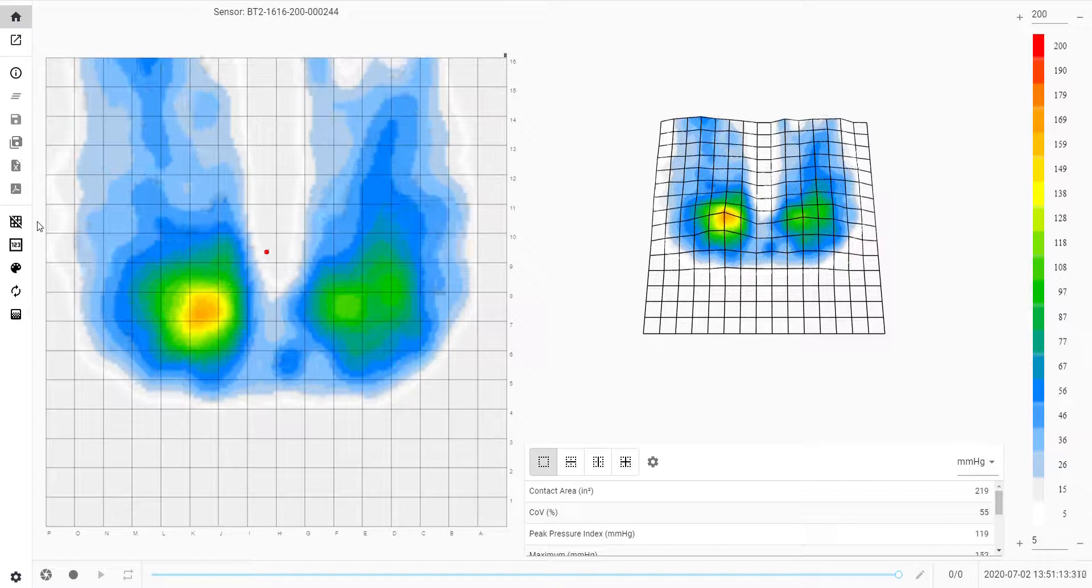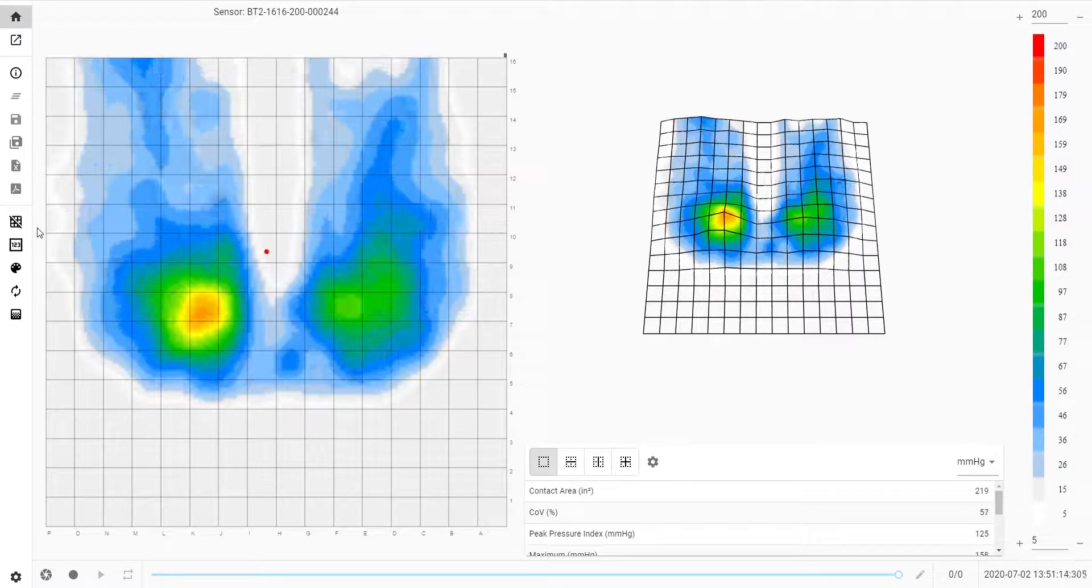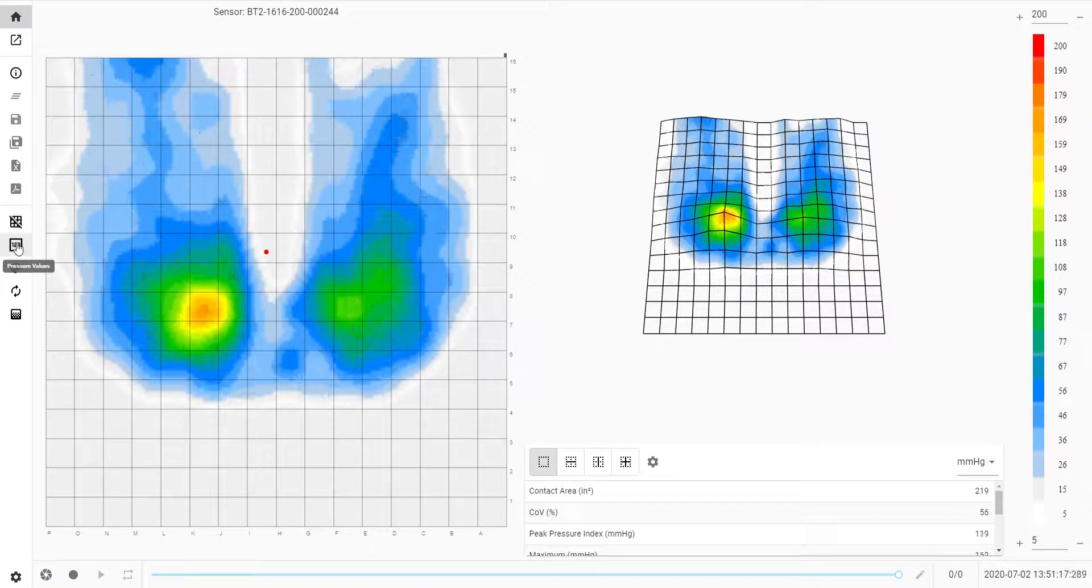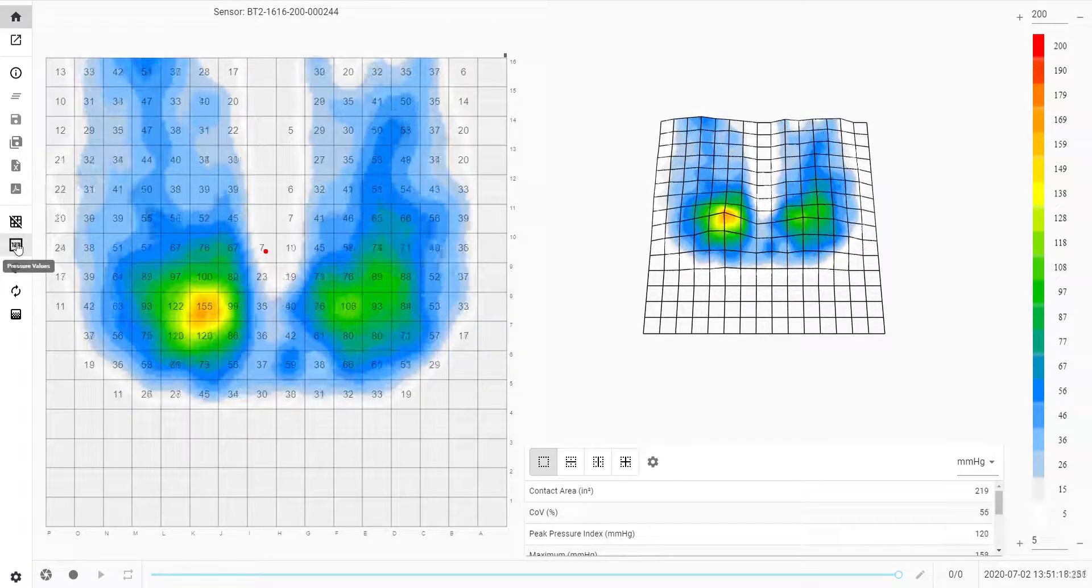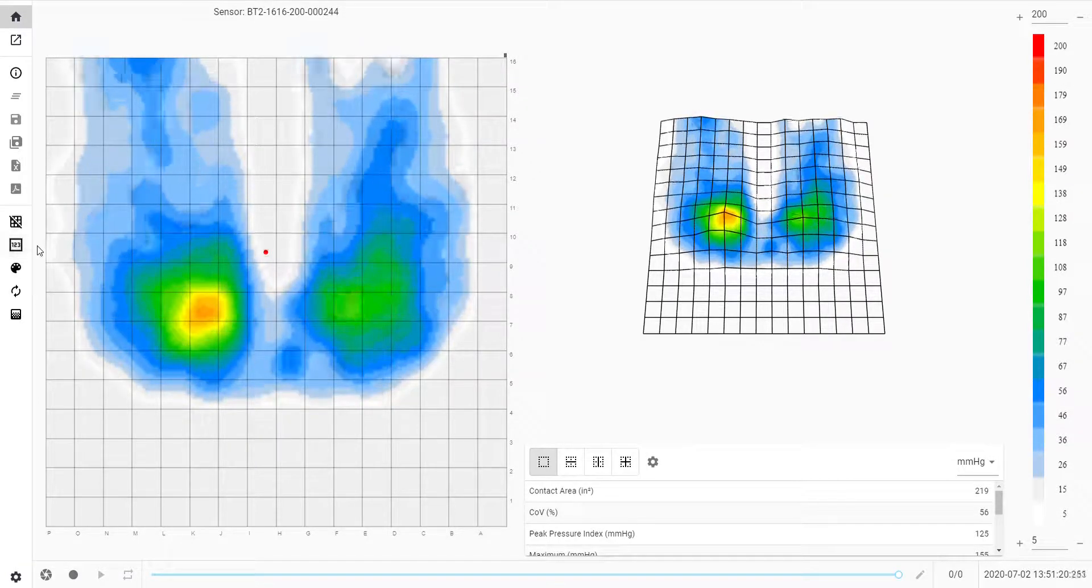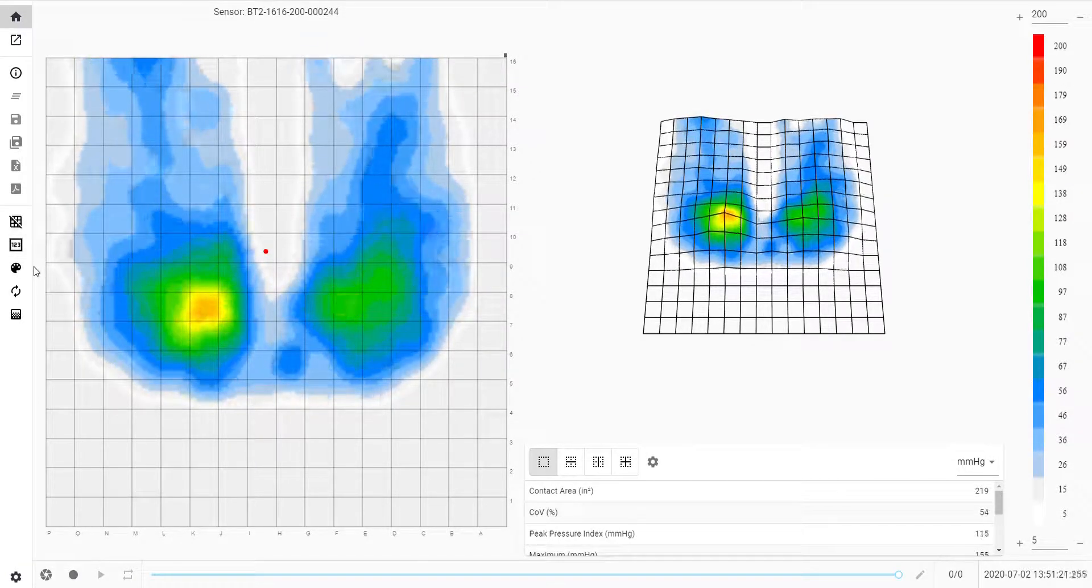Next up you can click on the pressure values icon. Here you can turn the pressure values on or off depending on preference for better visual.